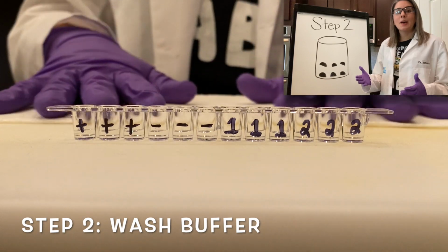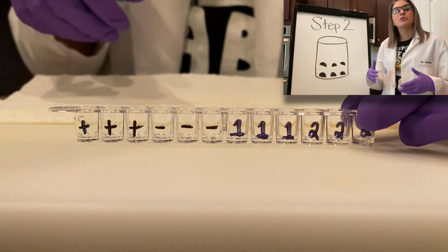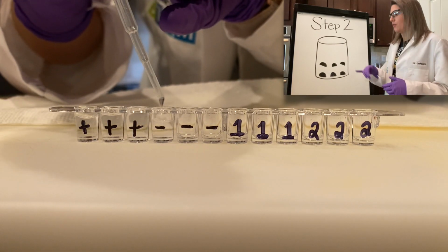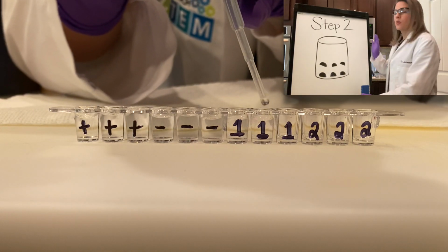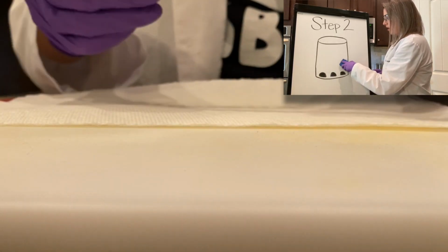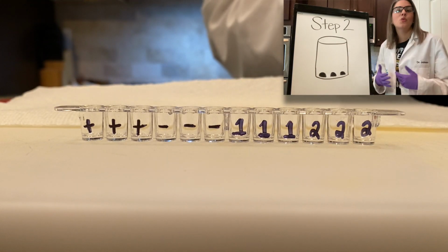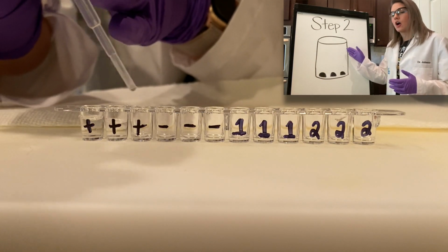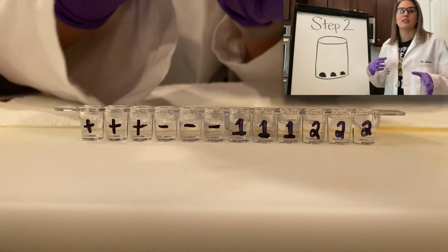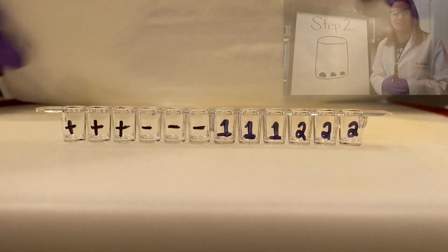Once that incubation time is up, it's time to use our wash buffer. Remember, that's our science soap or detergent that helps remove any molecules that haven't stuck to our polystyrene well. So these floaters right here, when we add that wash buffer in and pour it out, they are gonna go away, leaving just the ones that have bound or attached to the well. The wash buffer also is going to coat the inside surface of each well, preventing any other molecules from binding to it. This is going to help prevent false positive or false negative test results.